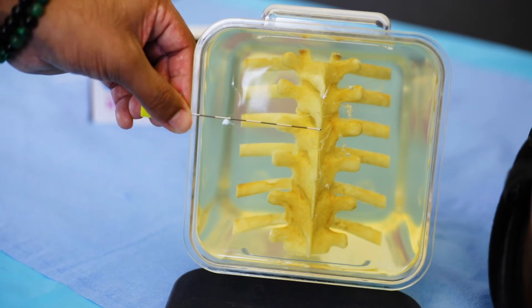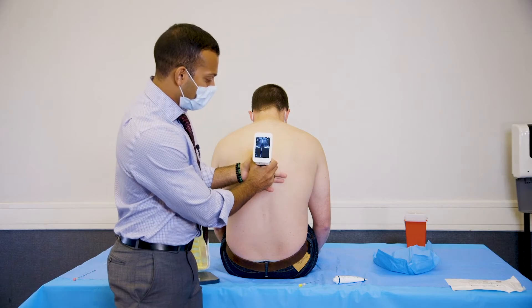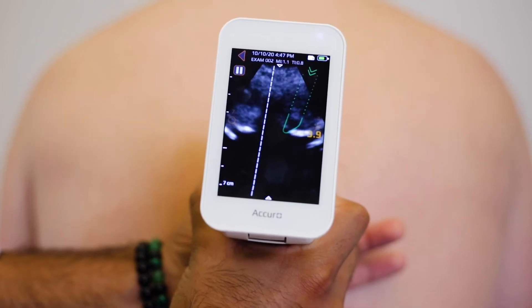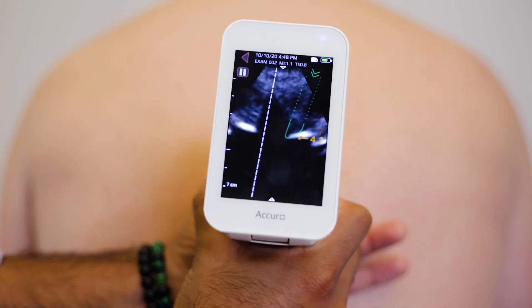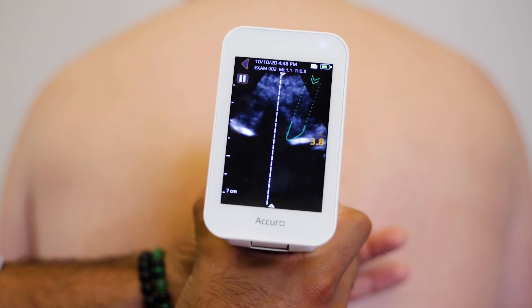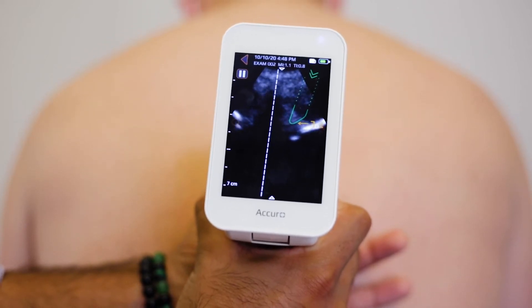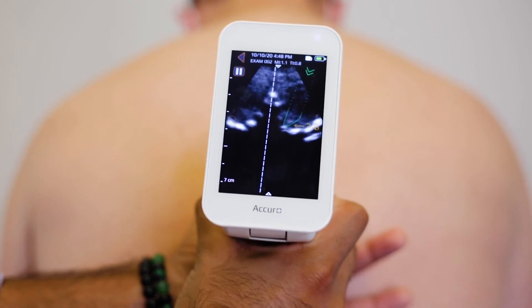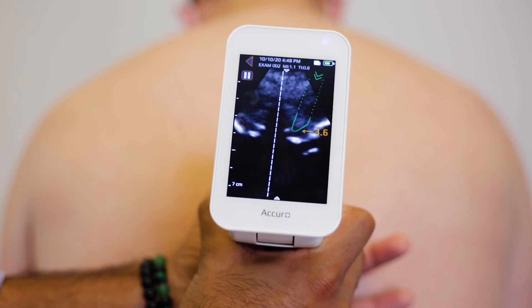You're then going to translate down caudally again to see your lamina, and you're going to see that this is the area in which you want to place your needle. Starting at the spinous process — the hyperechoic line at the top — as you translate upwards you're going to see the transverse processes laterally. Keep going upwards, those disappear, and you start to form the lamina as a hyperechoic line medially. Keep going upwards until you find the next spinous process, which gives you your window for needle placement. Go back down caudally and that lamina is where you want to place your needle.